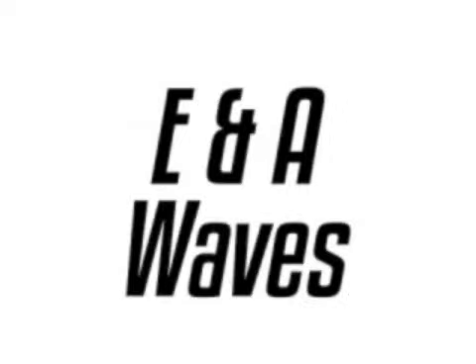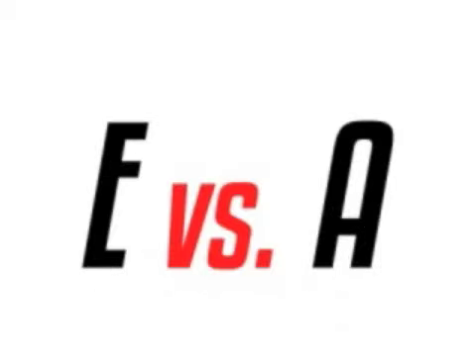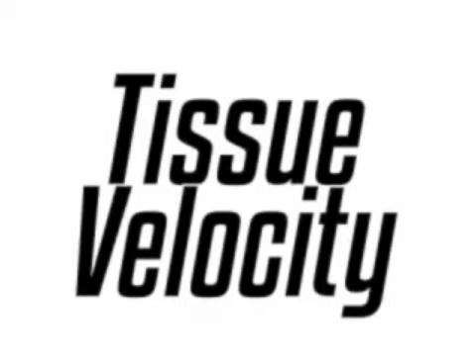So we are actually just a little over halfway through this entire talk, but there's no way we're going to torture you with 45 to 50 minutes of this. So just a quick recap of the last few minutes, what we went over. We had just talked about how the E and the A waves represent the velocity of blood flow through the mitral valve and give us a picture of diastolic function. E greater than A can be normal function, or E greater than A can represent pseudonormal function. So to differentiate those two, we do what's called tissue Doppler. Instead of looking at the velocity of the flow of the red blood cells, we're going to look at the velocity of the actual tissue.